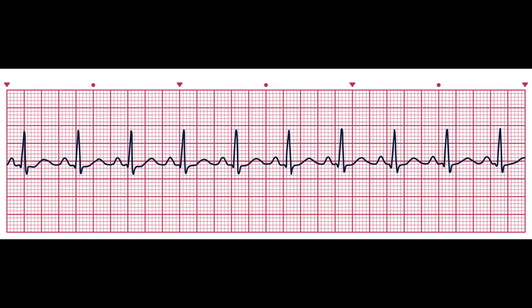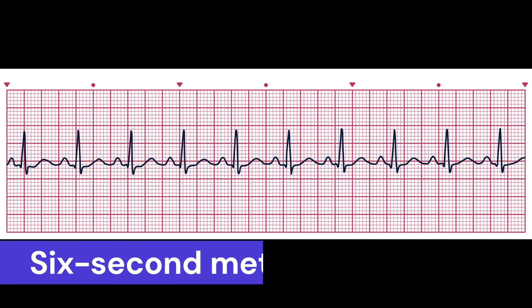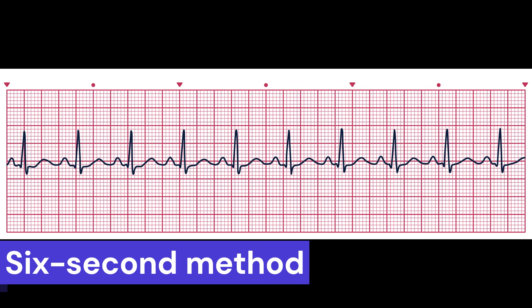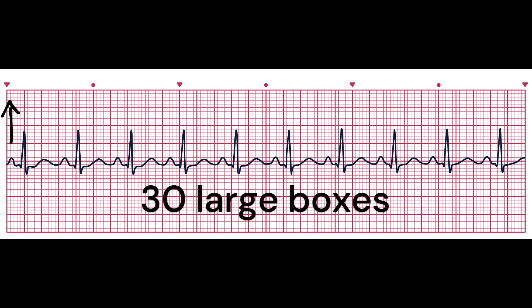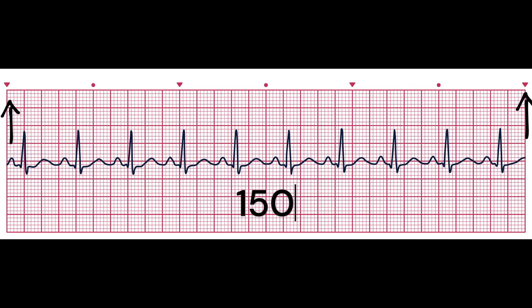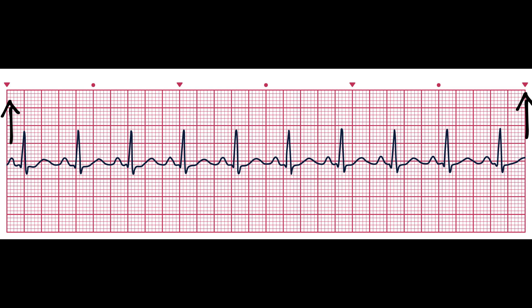The first method to determine the rate is called the six-second method. The first step is to choose a six-second interval on the EKG tracing. To determine the six-second interval, you need to count 30 large boxes or 150 small boxes on your EKG paper. These arrows point to the boundaries of six seconds on this EKG strip.